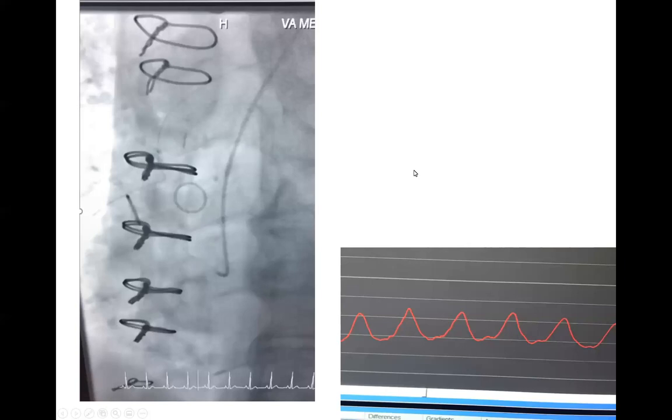This is an example of a case we did this week. This is a GR4 catheter. We're engaged toward the right coronary artery, and as soon as we engage, you need to recognize that this pressure is damped and ventricularlized. The tracing is horizontal between pressure peaks — this is a ventricularlized pressure tracing.